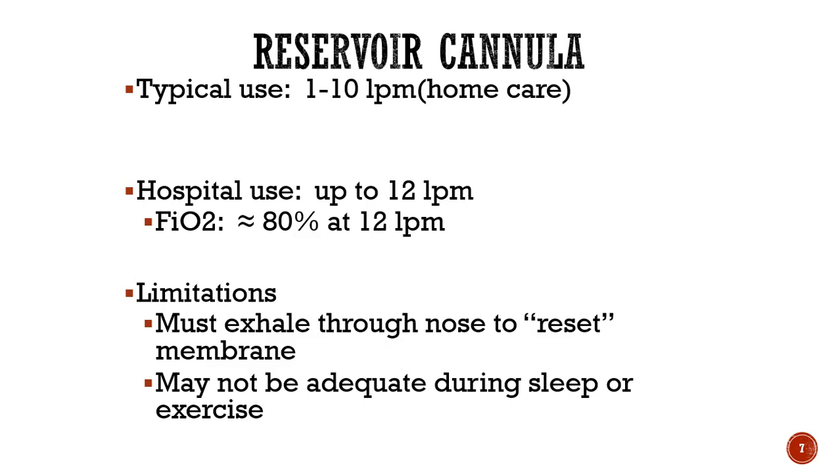Some of the limitations: you do actually have to exhale through your nose to reset that membrane. I don't know how often people do this perfectly, or if it is as detrimental as what the manufacturer recommends, because I have seen all kinds of variability when I've watched people wear these. I do know that if you do get moisture in there, or if you try to add humidity, it really will stick that membrane, and then you do see the function go down.